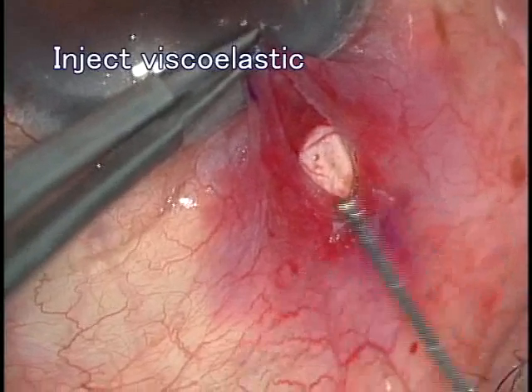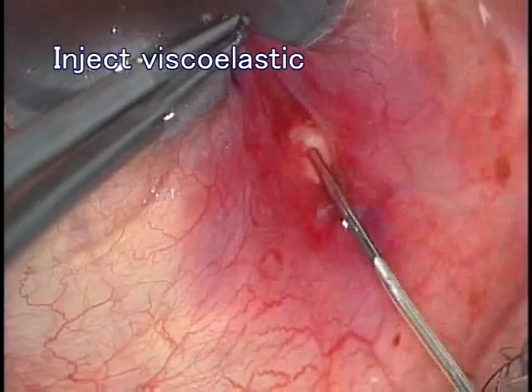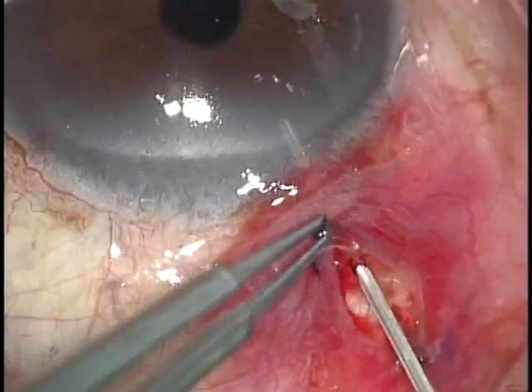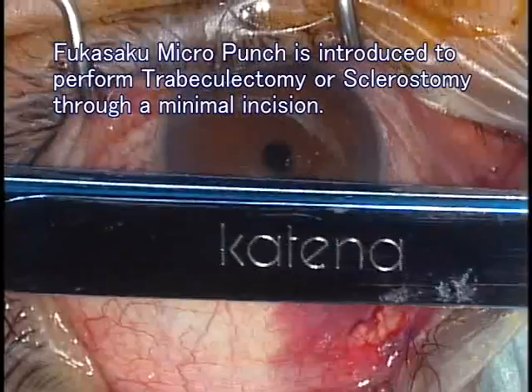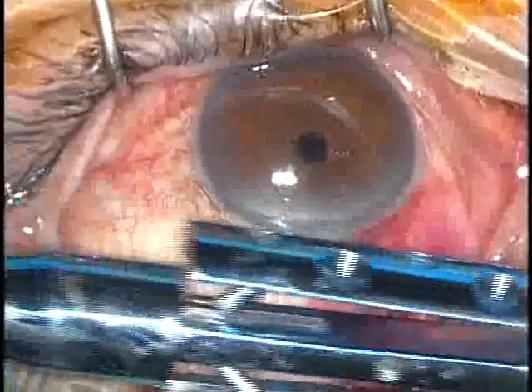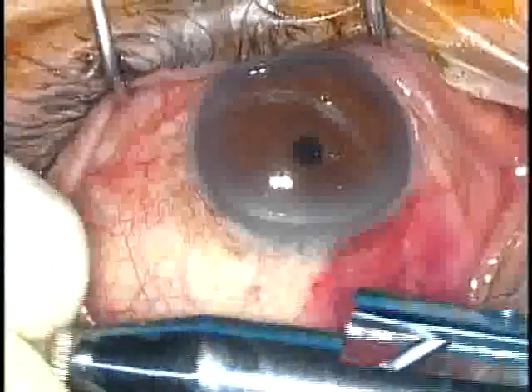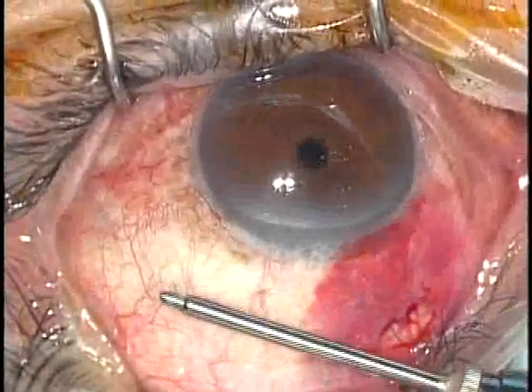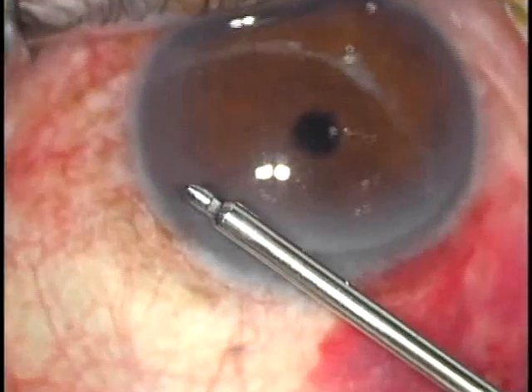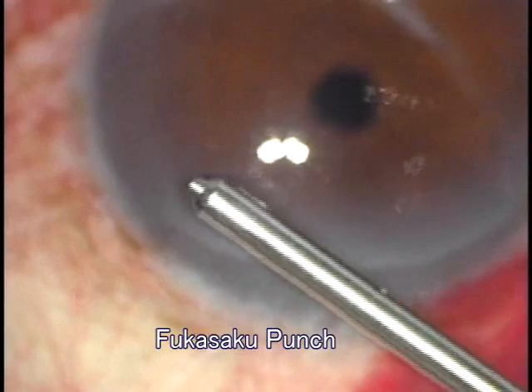I inject viscoelastic material to maintain the deep anterior chamber space. We designed the Fukasaku Micro Punch, produced by Katena Products Inc. This punch is 20-gauge size and can be introduced through a minimal incision, and can be controlled meticulously.